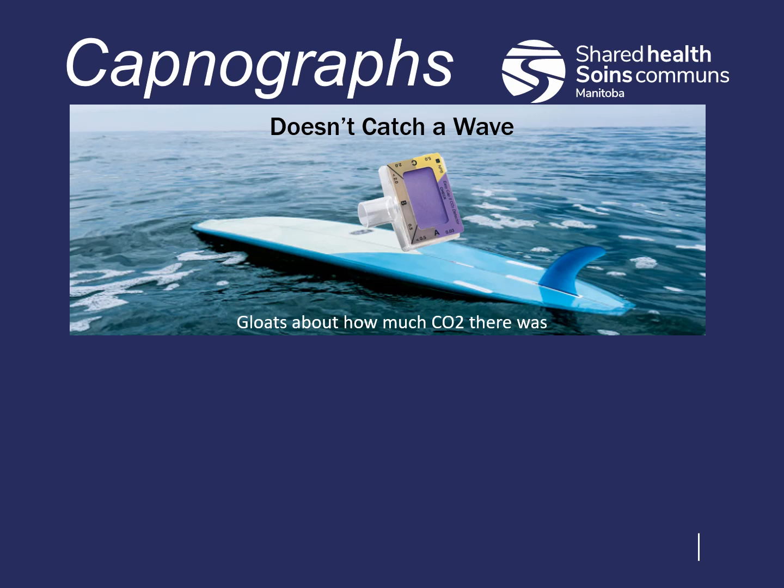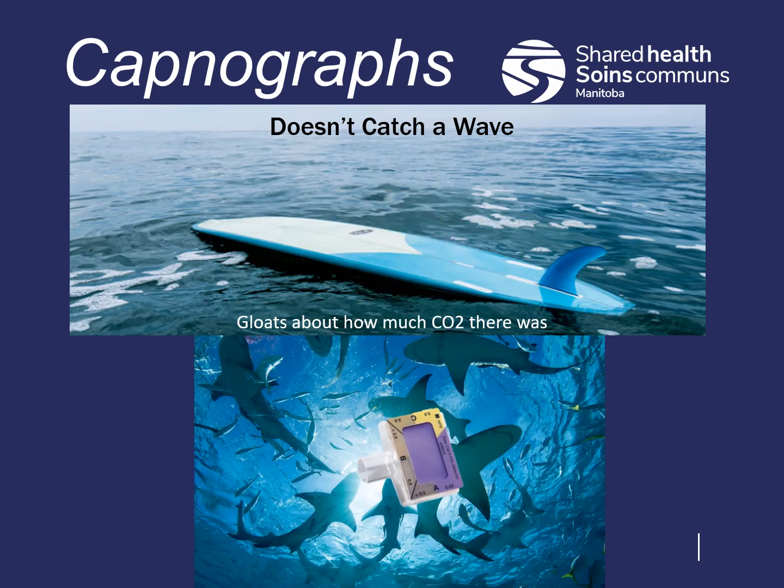Remember these colorimetric devices? The colorimetric was designed to give a quantitative end-tidal CO2 reading, but it was only able to do this for us once. It was useful in confirming placement of our airway devices, but otherwise it was pretty useless. So this is why they've been removed from truck and are now swimming with the fishies.